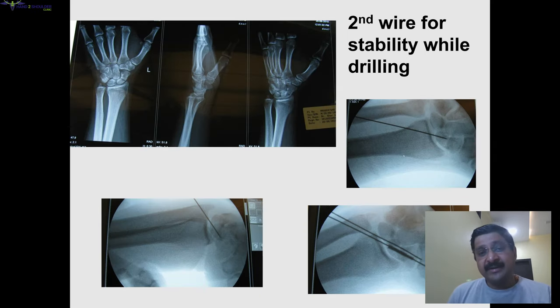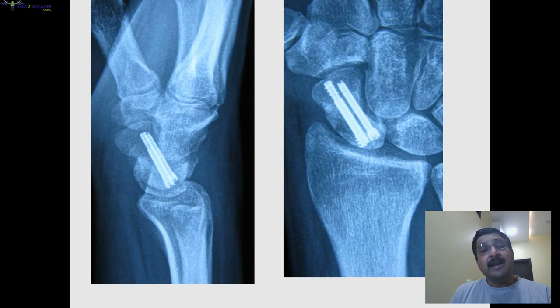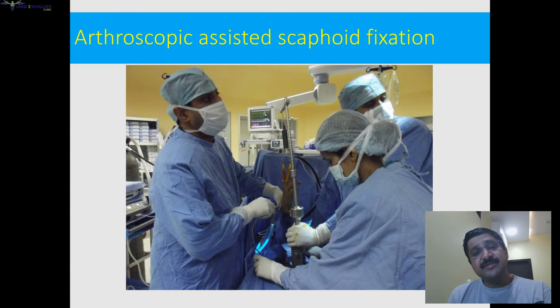You can remove the second wire, or if there is enough space you can pass a second screw over that wire to provide additional rotational stability. This was a patient in which we used a second guide wire because there was some gap and we wanted additional stability. We used a 3 mm and a 2.4 mm screw — the differential pitch screw automatically gives compression at the fracture site, while the second headless screw without a sleeve acts as a derotation screw.